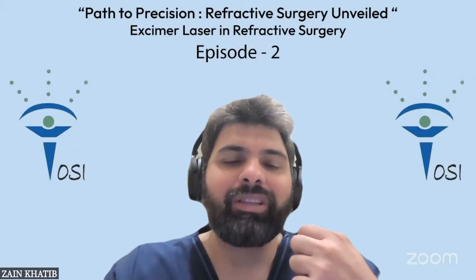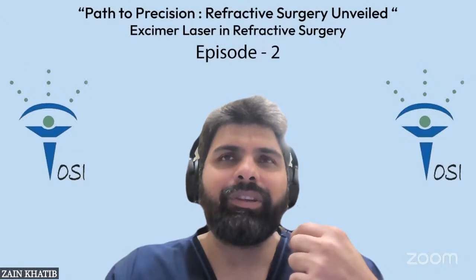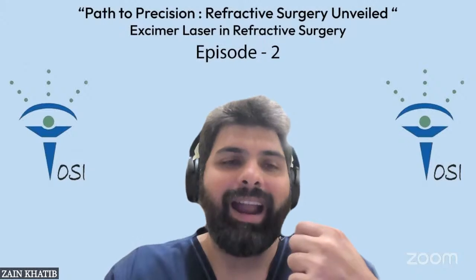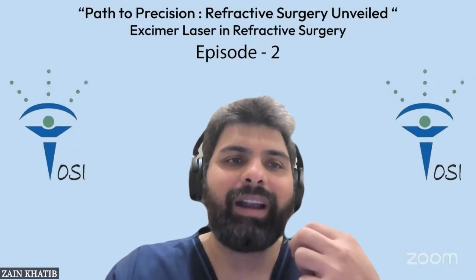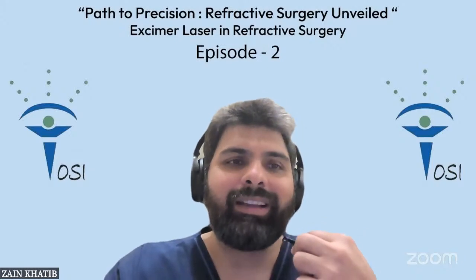The flap repositioning has to be very standardized, in every situation. And we should avoid trying to overhydrate the retracted flap, because that tends to swell up the flap and then it creates an epithelial gutter around. And that gutter then forms a nidus for epithelial cells to grow if we are doing a relift later on. So that is something that is important.